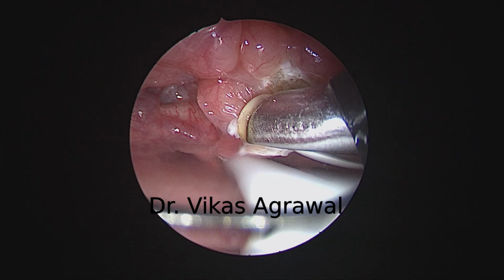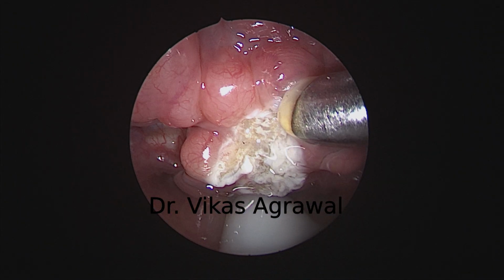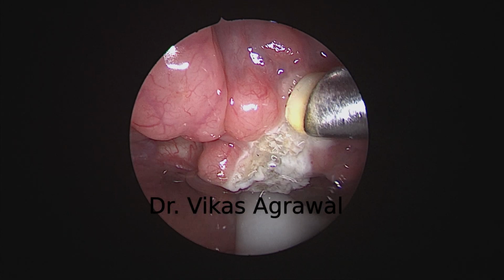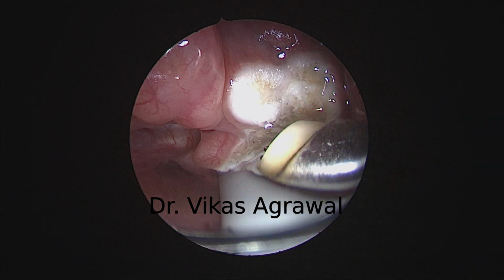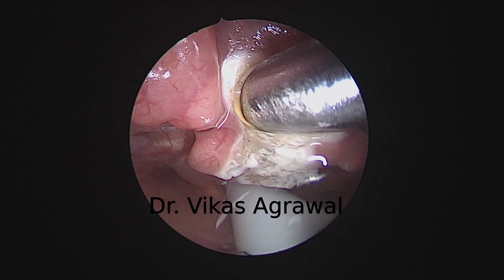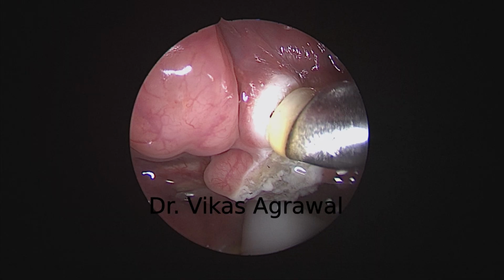These lymphoid tissues may be ablated, but first I'm coagulating it so that the blood supply goes down. And after that, if needed, I will ablate, because this area can turn really dangerous if there's bleeding in the post-op period. So this lymphoid tissue I am ablating now.